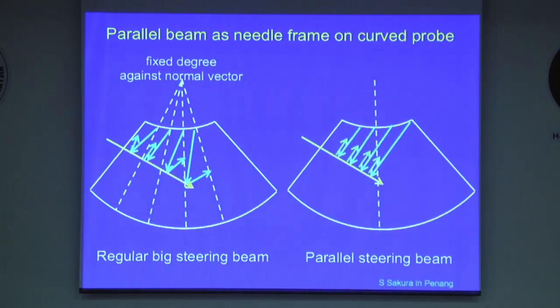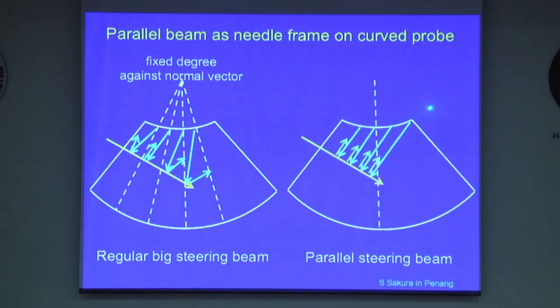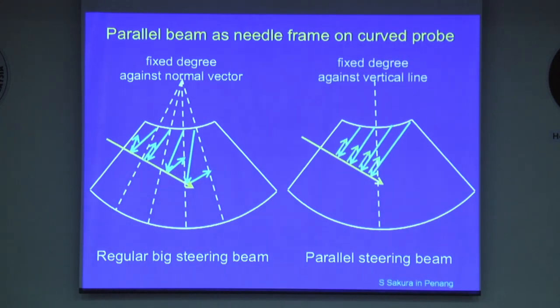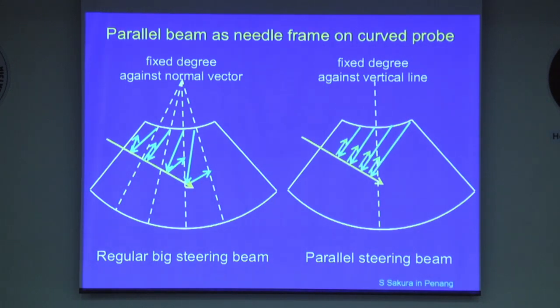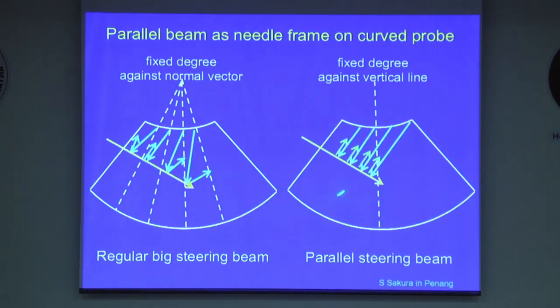In contrast, with the parallel steering beam shown on the right, all the needle beams have the same angle against their vertical line. So you can imagine that with regular beam steering, some of the reflections don't go back to the probe. But with the parallel steering technique, you can expect more reflections to come back to the probe.